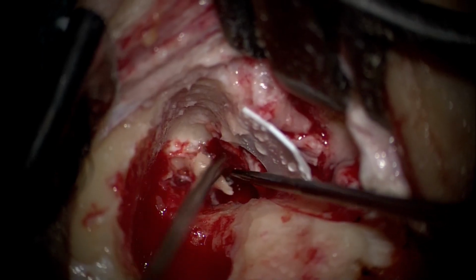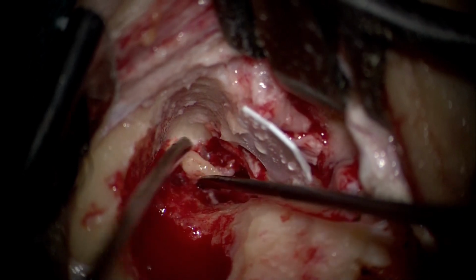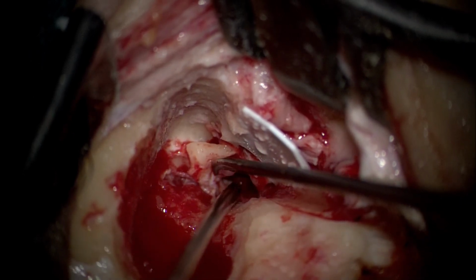You can see the incus body, which is lying loose and is being separated from the epithelium. Of course, this will be discarded.